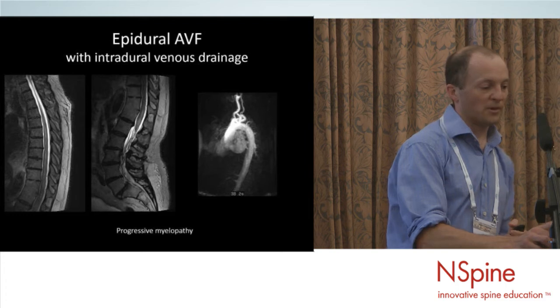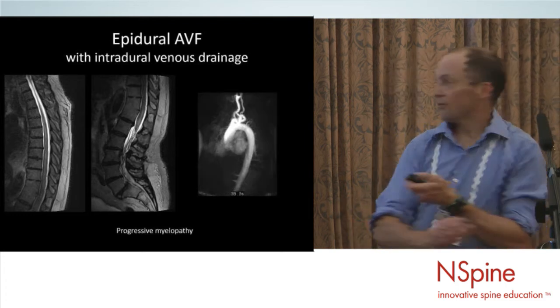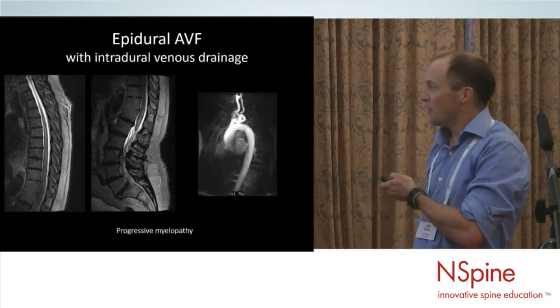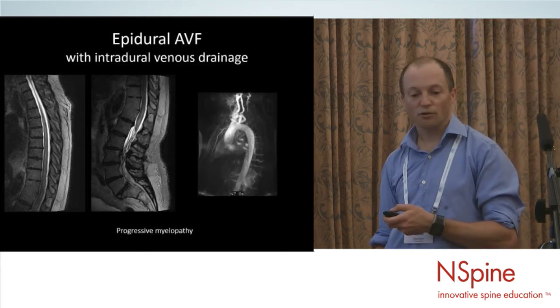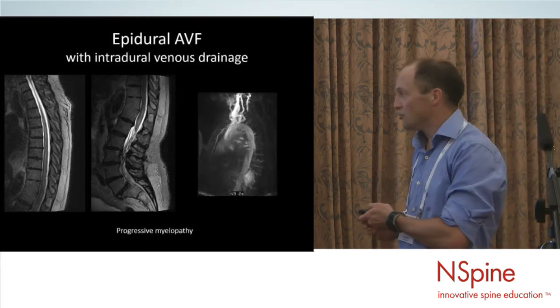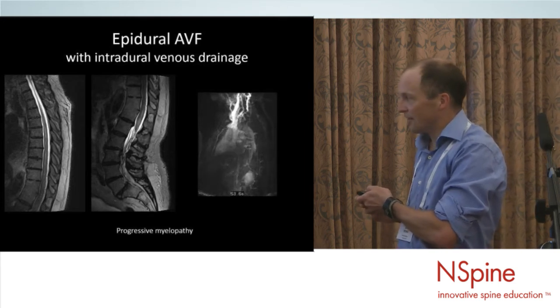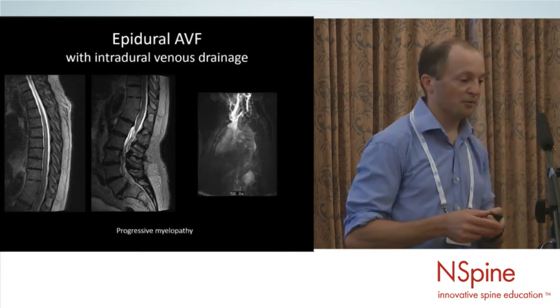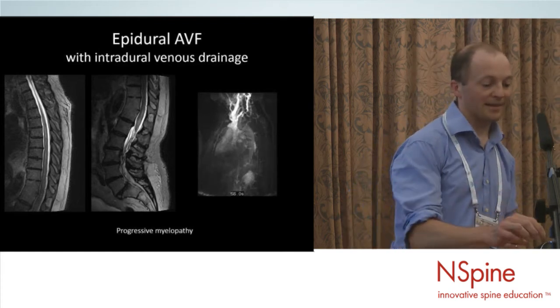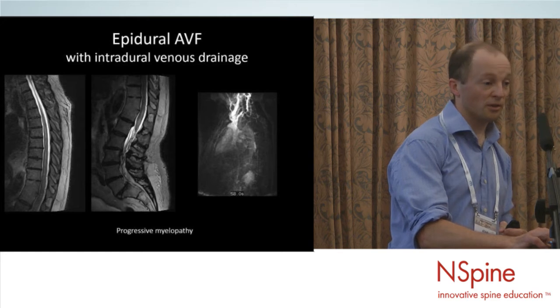I would say about MRDSA, this image here on the right is us trying to do some MRDSA, and we use this nicely to identify those feeding arteries rather than contrast-enhanced MRA. You can just see here it's coming in, a little bit of flashing of the vessels here, and so we know roughly where to start looking on the angiogram. I agree entirely, using modern techniques does help limit the contrast dose and the radiation exposure to the radiologist and to the patient.